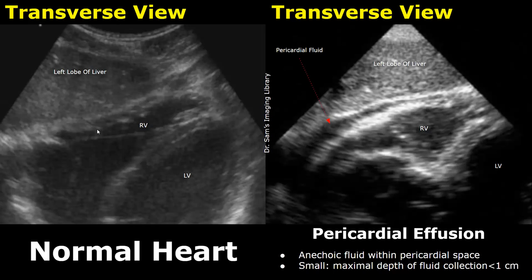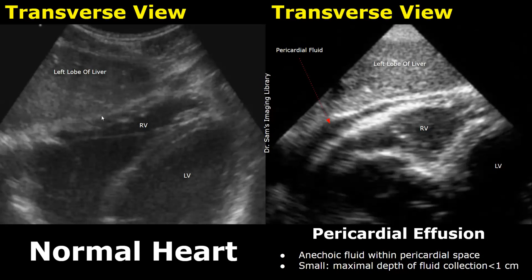Starting with the pericardium, the first image shows a normal pericardium. Notice how the heart is encased within a thin, smooth, and echogenic line, which is the pericardium. In this image, the pericardial space is free from any excess fluid accumulation, and the heart has a normal range of motion.